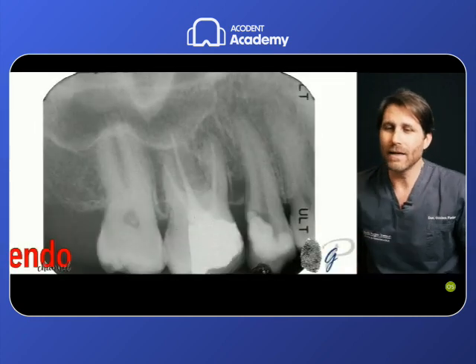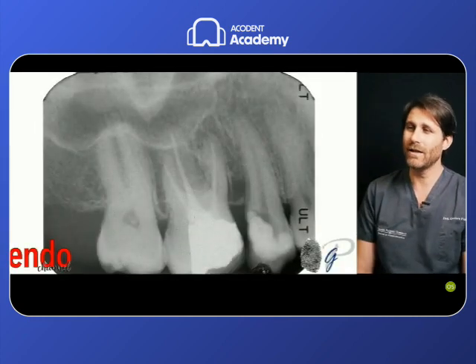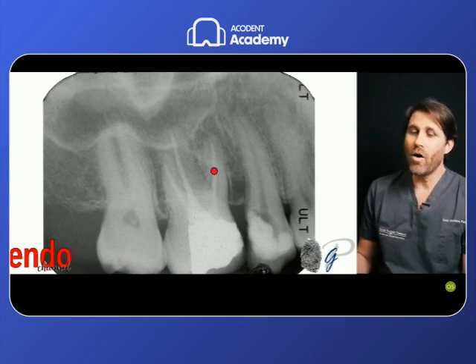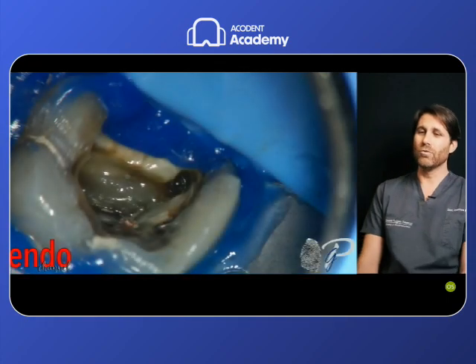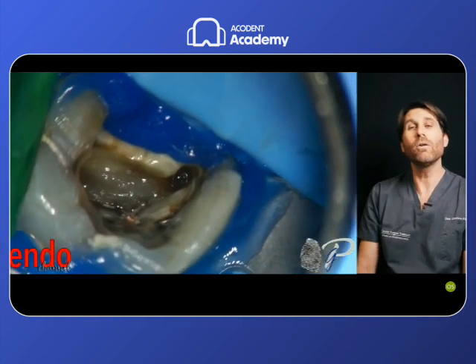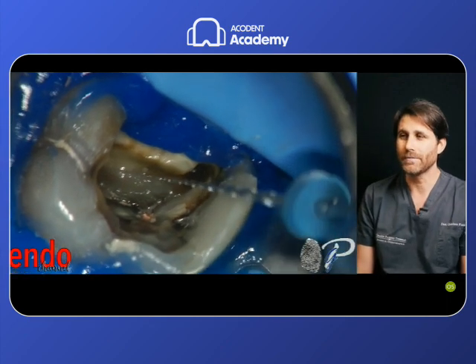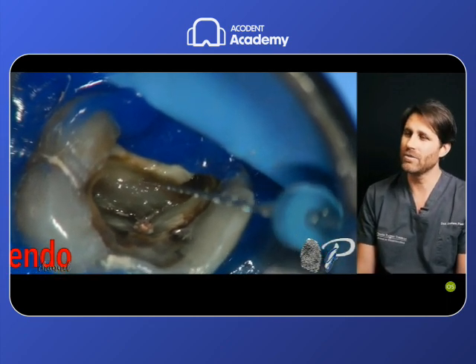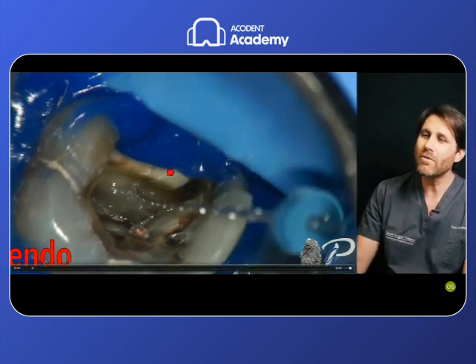And this is the classic example case that I do. A retreatment of this first upper molar, with a lesion on the mesiobuccal root, obviously an MB2, a missed MB2 root canal. Here we summarize all the techniques that we have seen up to now in orifice location, glide path preparation, scouting, and instrumentation. Look, I have found the orifice.